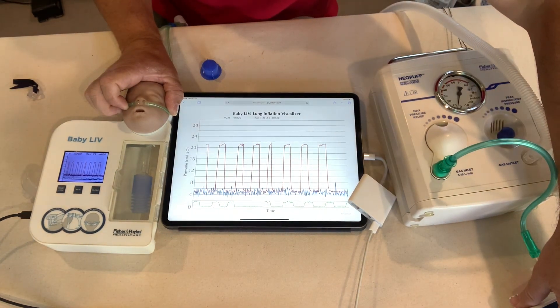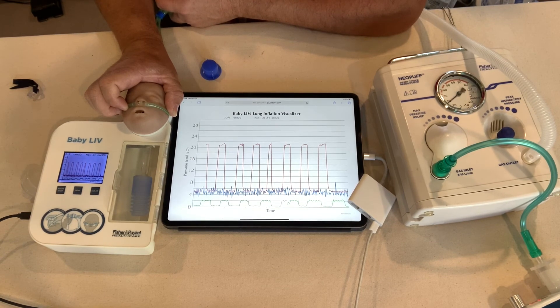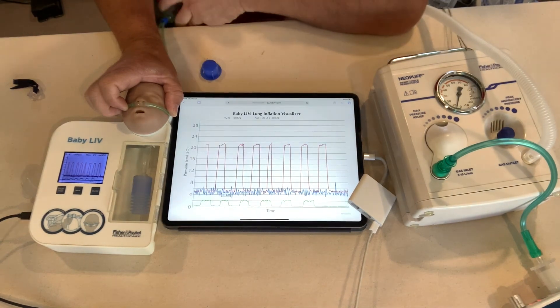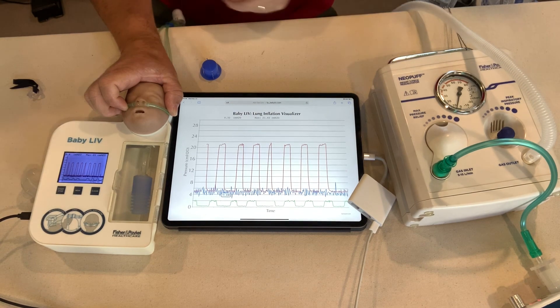So I'll cheat a little bit, increase the flow — now my Neopuff is telling me 20 over 5, I'm happy with that. But when we look at what's going on internally in the lungs of the baby without the chin strap or pacifier, it's only 2.5 over zero — which is essentially nothing. Very interesting. Great discussion — thank you Omar and David, and I hope this was helpful. Talk to you all later.